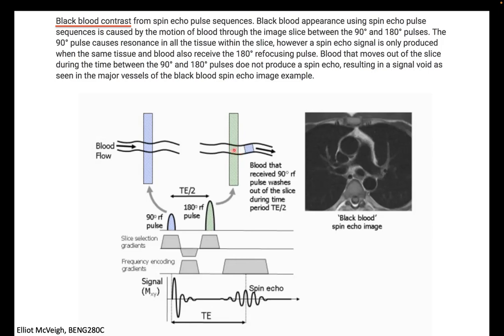And what happens is, it's called black blood imaging. So here is the descending aorta, and we have virtually no signal from the descending aorta. Not because the time constants like T1 and T2 would give you no signal. It's because the blood just isn't there when you do the 180-degree pulse. So you get this really nice contrast mechanism, because now you can see what is vessel wall versus blood, because all the blood is washed away. That's called black blood imaging.